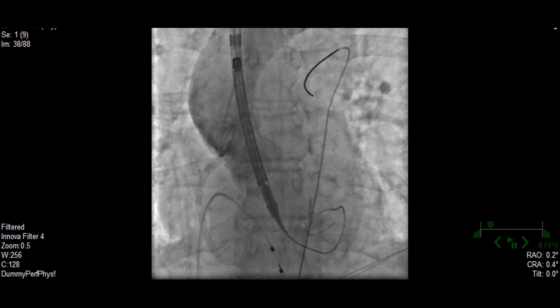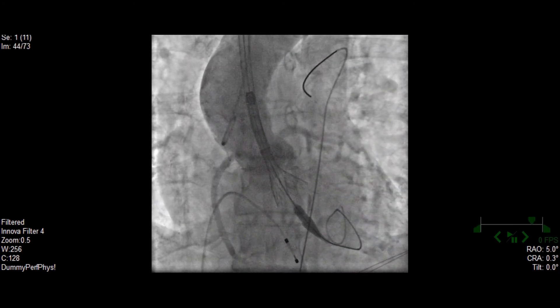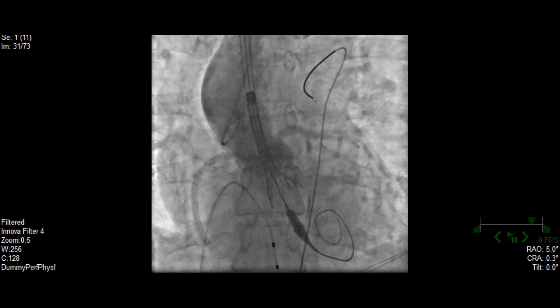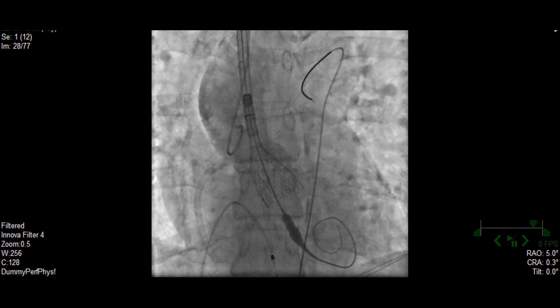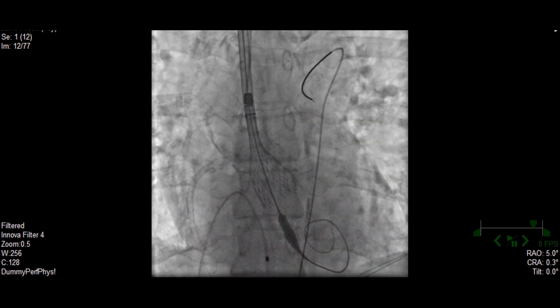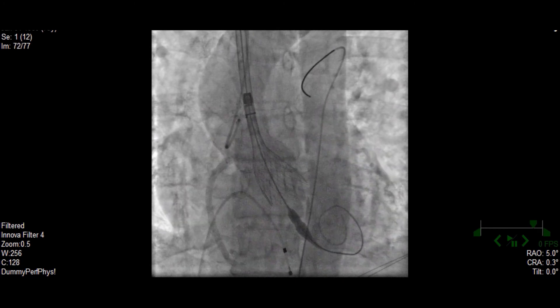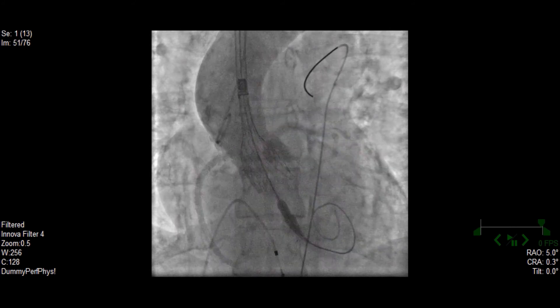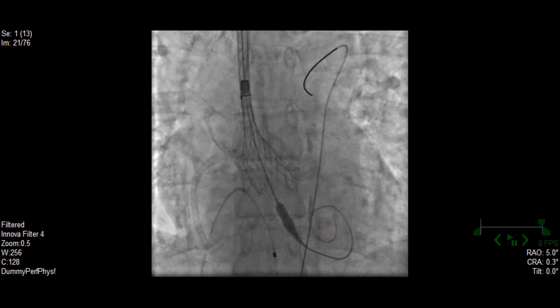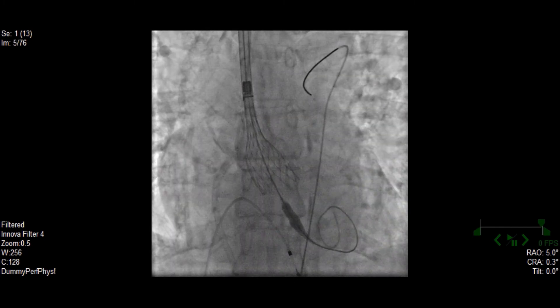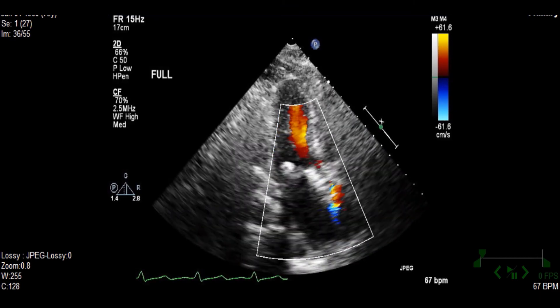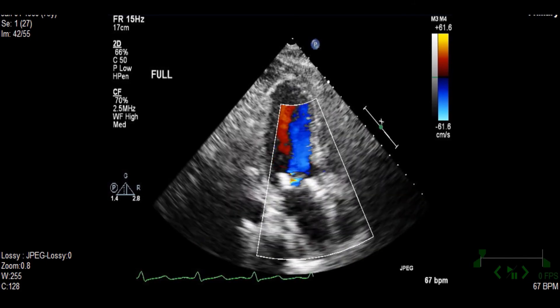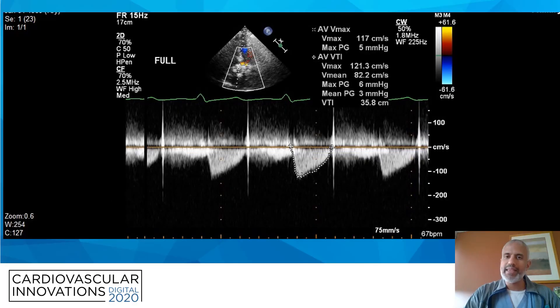As you can see, we were right there at the level of the annulus. We then started deploying the valve with a pacing rate of approximately 100. However, when coming from the carotid you have an ability to dive deep, and at 80% deployment we were quite deep. Luckily, we had the ability of retrievability — so we retrieved the valve and recapped. We deployed higher, closer to the annulus at about two to four millimeters depth. Once fully deployed, we reviewed the echocardiogram, which showed very nice deployment with no impingement on the mitral valve. She did have significant mitral annular calcification, but there was no impingement. Our post-deployment gradients were excellent with a mean gradient of 3 millimeters of mercury.